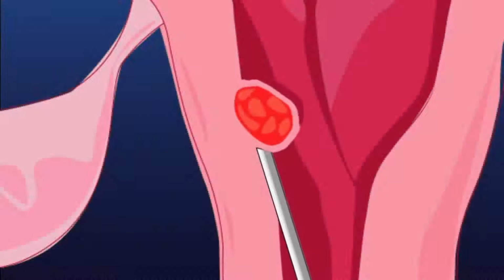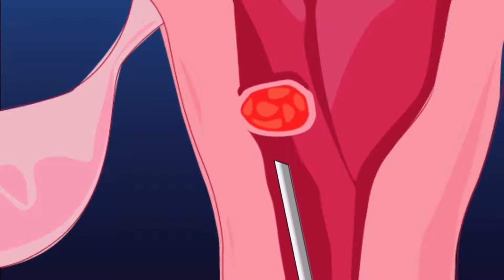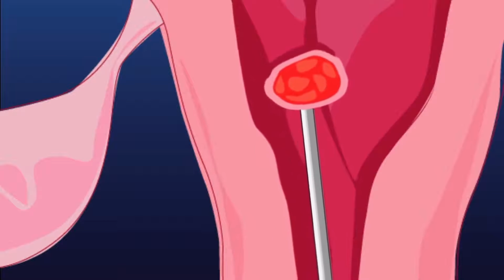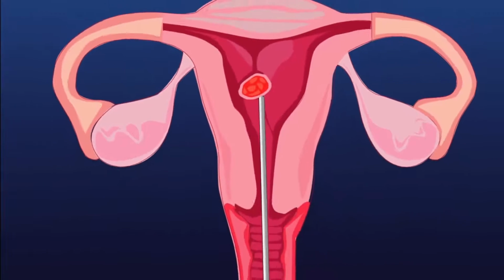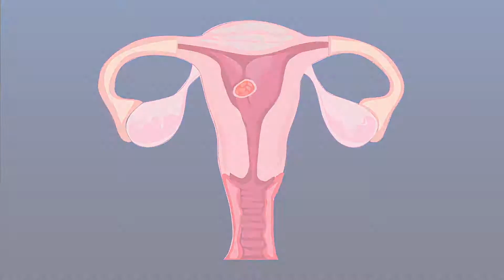As the illustration shows, with the telescope's distal end bevel, pressure is applied over the reflection angle between the fibroid and the endometrium in order to access the fibroid's pseudocapsule. Blunt dissection is performed in this plane with the hysteroscope's tip always under direct visualization until complete fibroid enucleation is achieved.